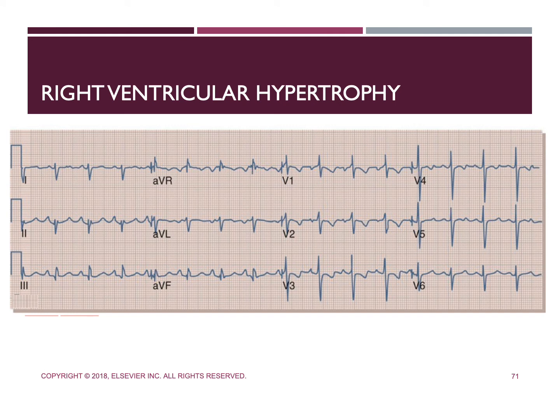So what we're looking at here is an ECG strip showing RVH, or right ventricular hypertrophy. What we're seeing with this is a tall R wave in the right precordial leads. We're also seeing downsloping ST depression in the chest leads.